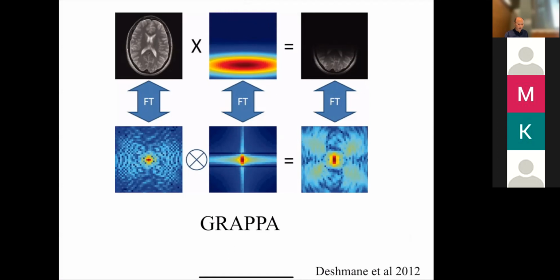Okay. So here's the idea behind GRAPPA: for SENSE we've thought about everything in terms of solving these linear systems of equations, right? And we're like, okay, how do we solve? The genius behind SENSE is it took this big linear system of equations and broke it down into lots of little equations. GRAPPA has a slightly different approach, which is also ingenious, and it's based on this insight.